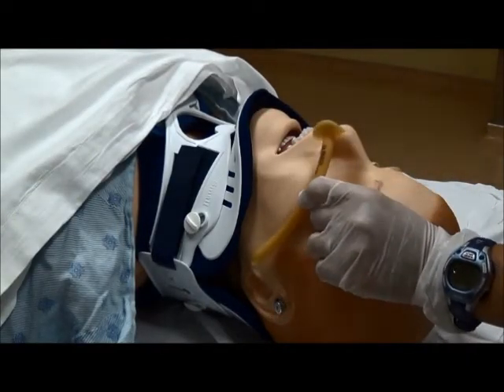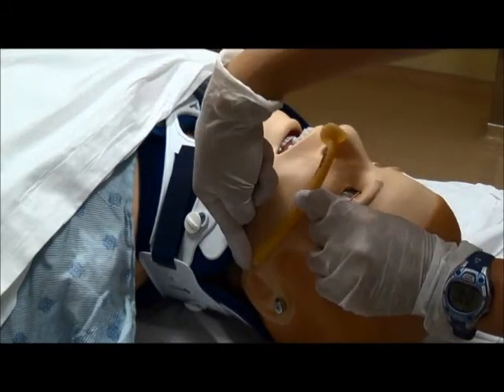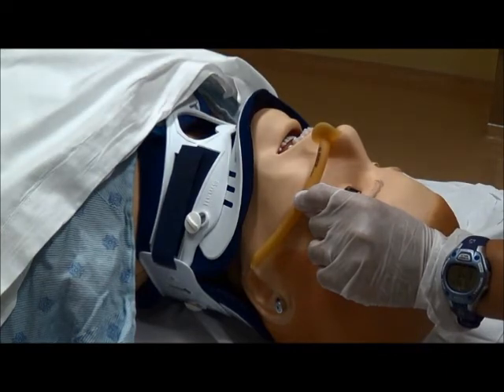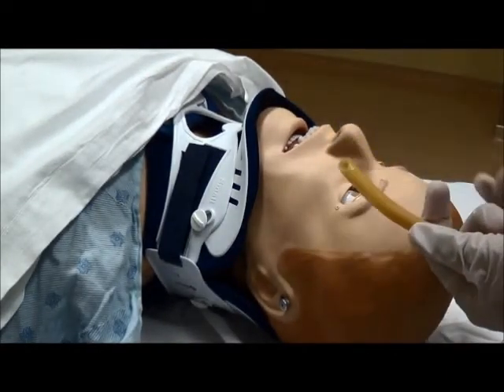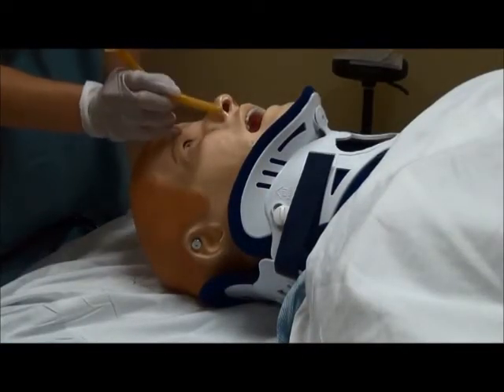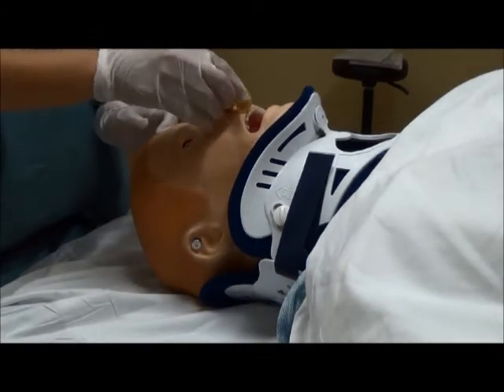First, find the correct size for the patient. The length should be the distance between the patient's nostril to the angle of the mandible. Lubricate the nasopharyngeal airway. To insert in the right nare, point the bevel towards the septum and insert following the curvature of the patient's airway.